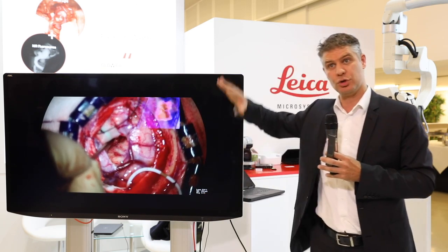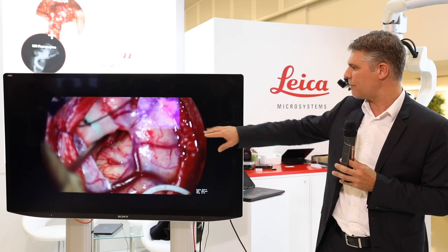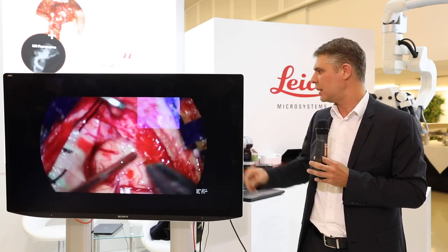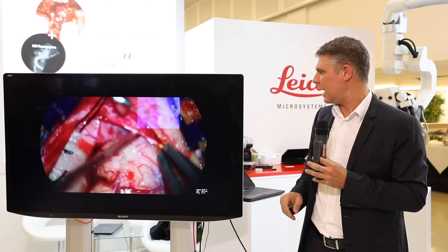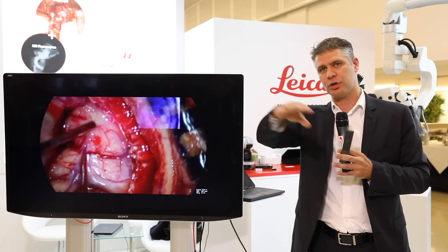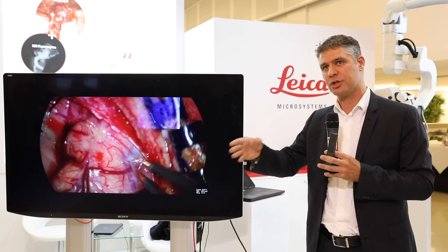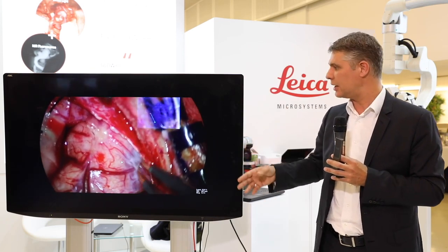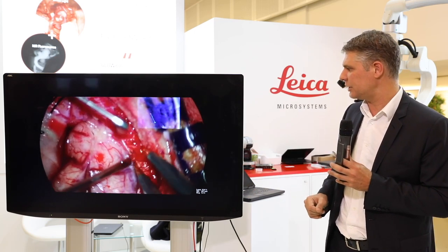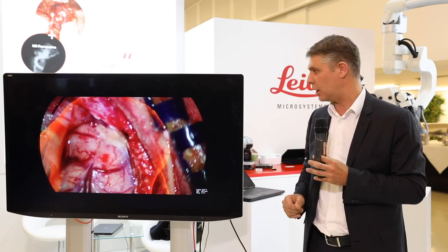The tumor is somewhere here and it is large. We mark the cortex a little bit to remember where the tumor is most likely on the surface. Then we look at the front edge to make the contour of the whole tumor, going on one side and the other side of the gyrus, defining the best place to cut. Then we cut the pia and start removing the tumor which is below.